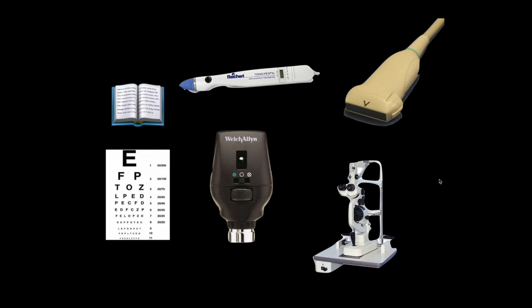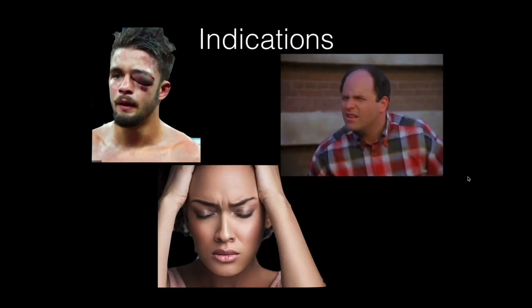And again, in the acute setting, it's pretty reasonable to be doing this. And one last point about this too is that there are a lot of settings where you don't have access to an ophthalmologist. This is even true in our own hospital system, where we can't talk directly to an ophthalmologist, and ultrasound can really enhance what you're doing with the patient. So what are your indications here?